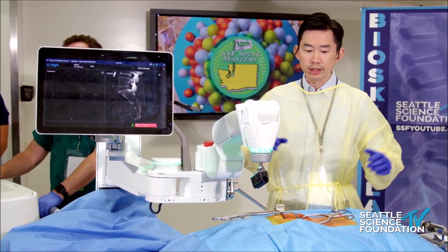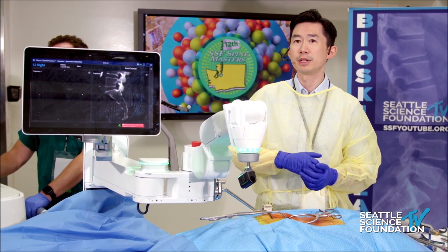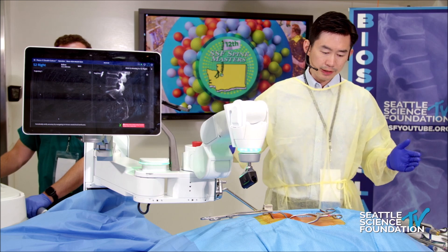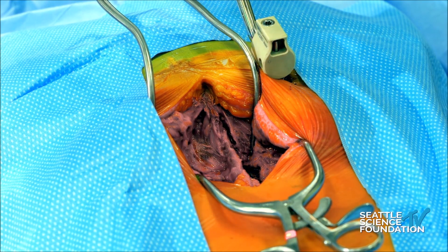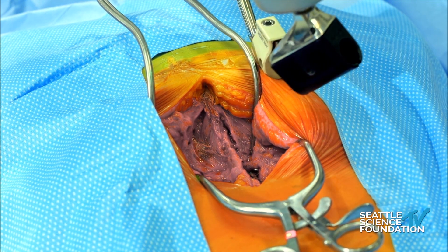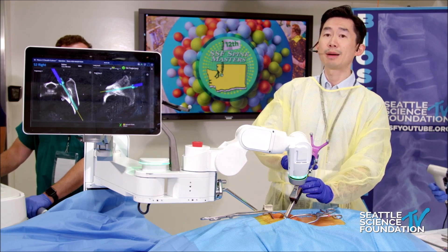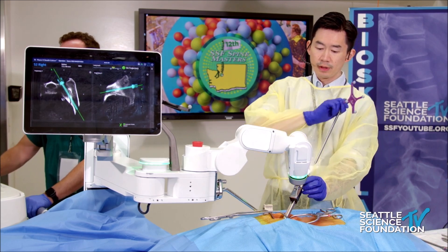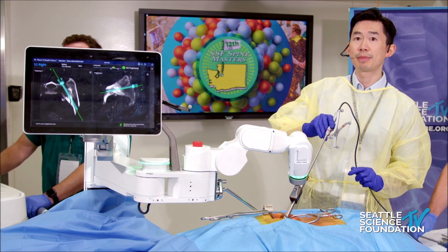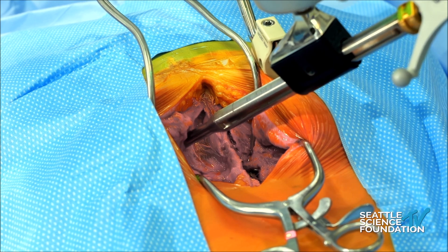While it is fairly straightforward, there are just a few tips that I certainly learned over the years as we try to figure out how to make this a good workflow. So you can go ahead and send it to the trajectory. For this particular cadaver, head is over here. I'm going to be placing a right-sided S2ALI iliac screw. And for this particular robotic system, the first thing that's done is going to be the navigated cannula and dilator. So you can see here a good apposition of the trajectory of that S2AI screw.